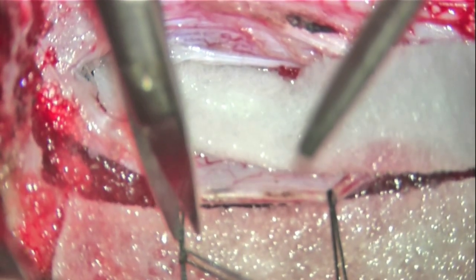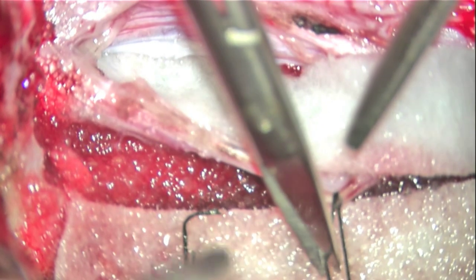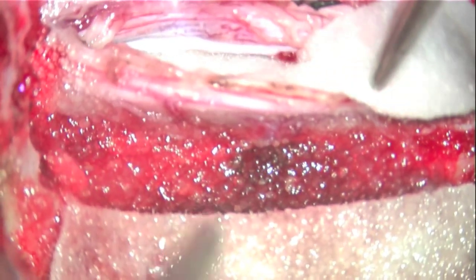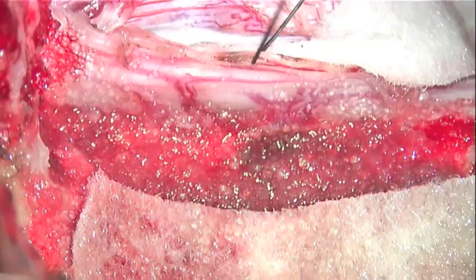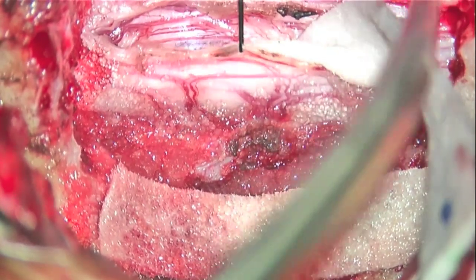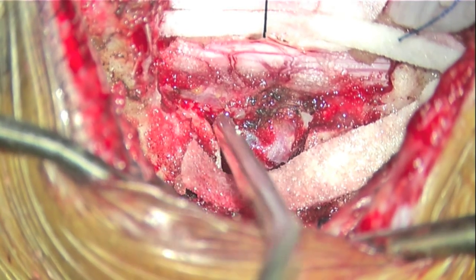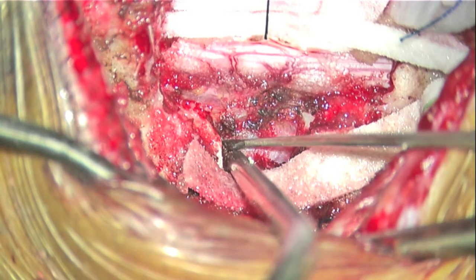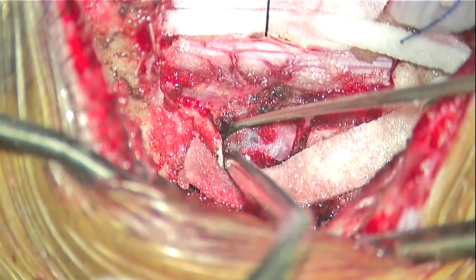The lateral dural tenting sutures on the left side are removed, and the dura is flapped contralaterally to expose the extradural foraminal and paraspinal component of the tumor. The key to safe removal of the extradural component of the tumor is to carefully maintain the dissection directly on the capsule of the tumor at all times.